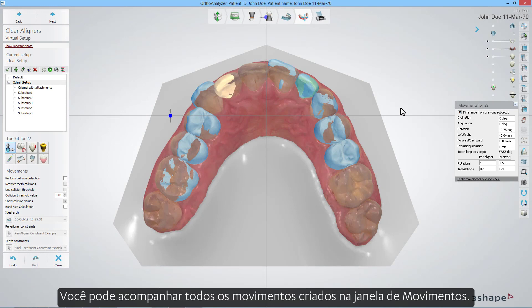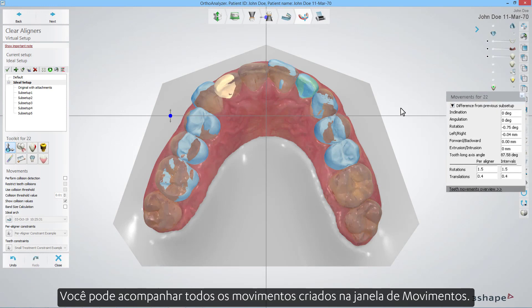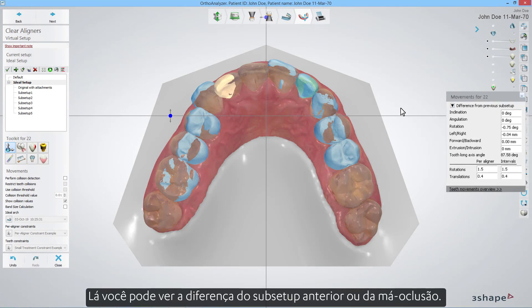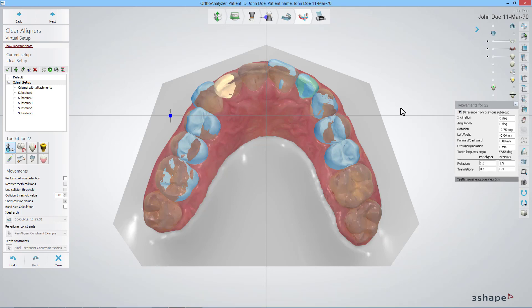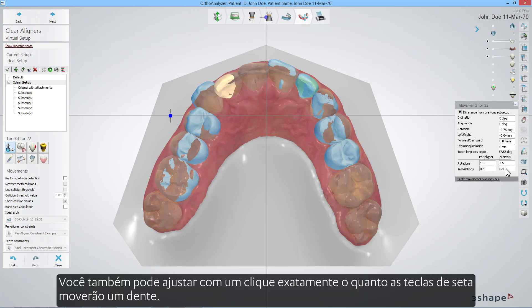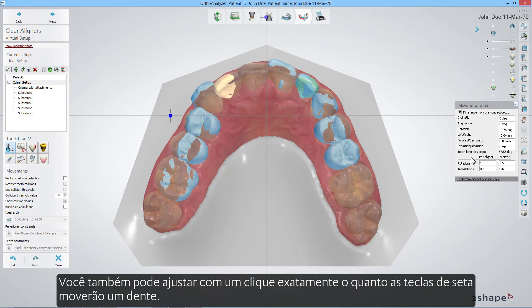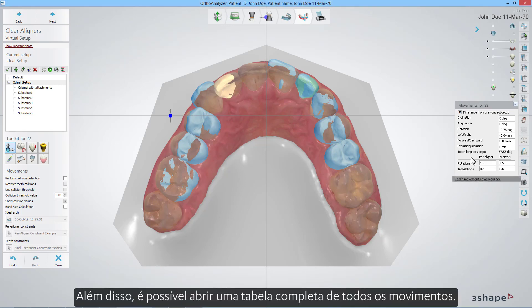You can keep track of all the movements you create in the movements window. There you can see the difference from the previous sub-setup or the malocclusion. You can also adjust exactly how much the arrow keys will move a tooth with one click. In addition, it's possible to pull up a complete table of all the movements.